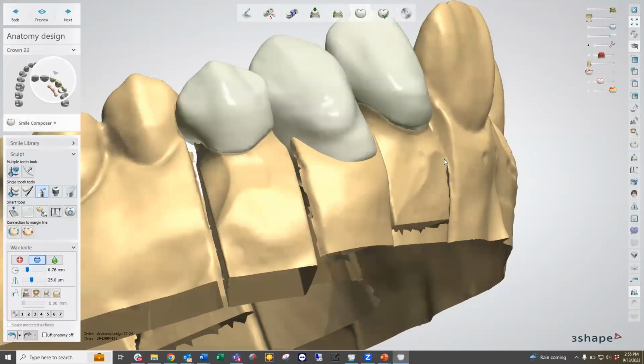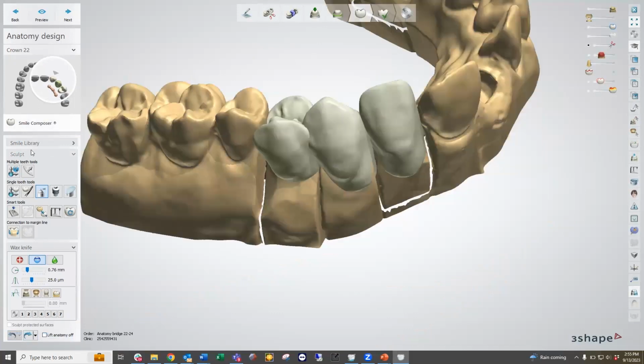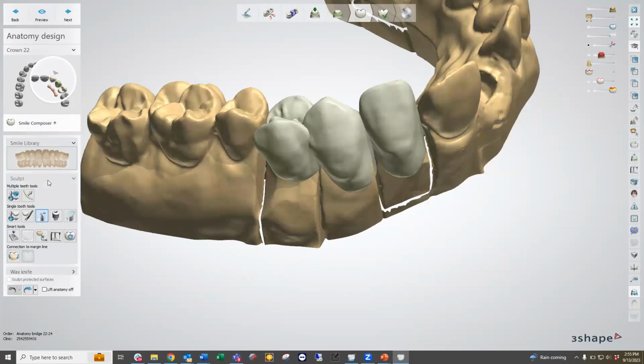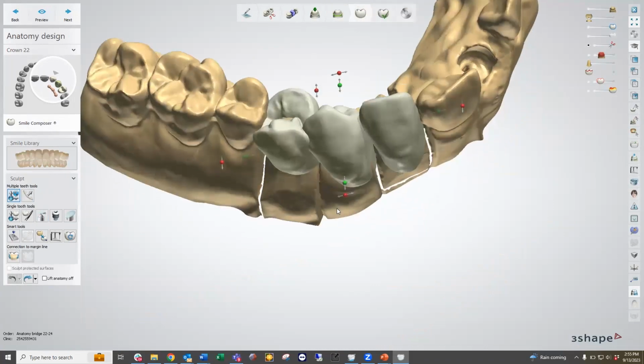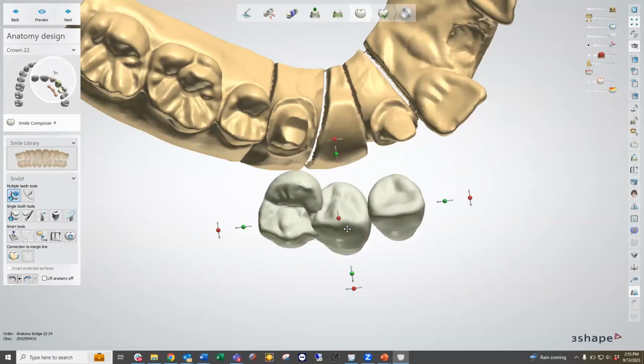So with this stage, we now go into the same option. Again, it automatically connects to the margin line. I always undo that, so I start with 3 blank teeth. And again, I can change my smile library if I wanted to, but I'm just going to use the one that we currently started with. And first off, I'm going to start with group transformation. Group transformation basically allows us to take the teeth as they are setting in as a group.